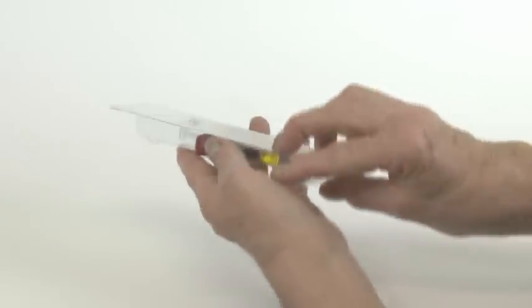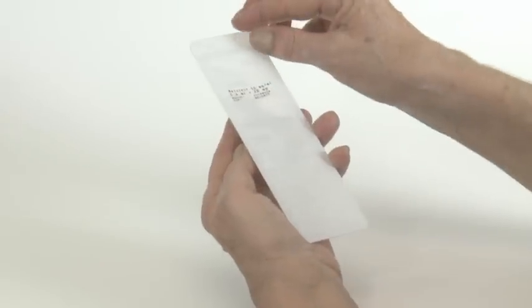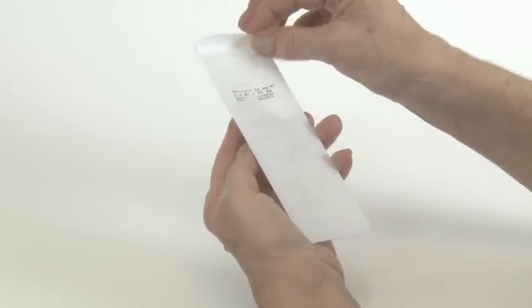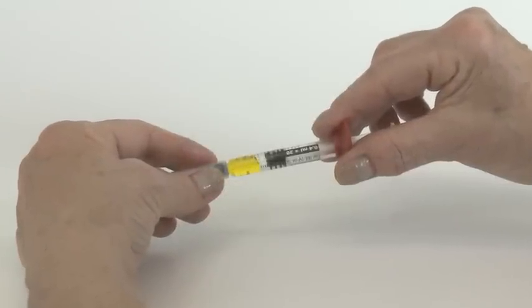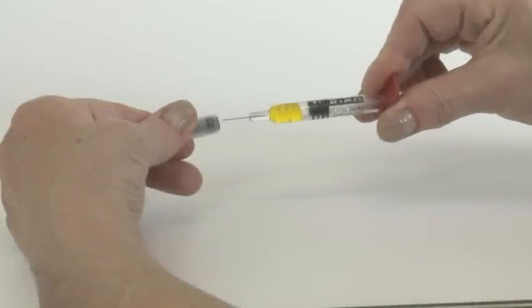Hold the plastic packaging containing the syringe level and peel back the white paper cover. Remove the syringe and put the packaging in the dustbin. Hold the main part of the syringe securely and remove the needle cap by pulling and twisting at the same time.